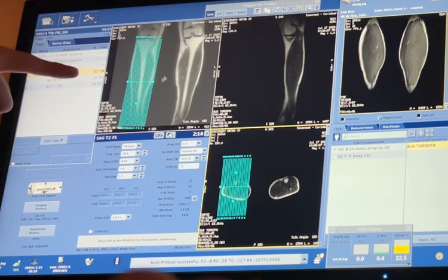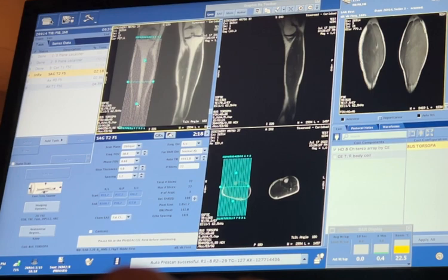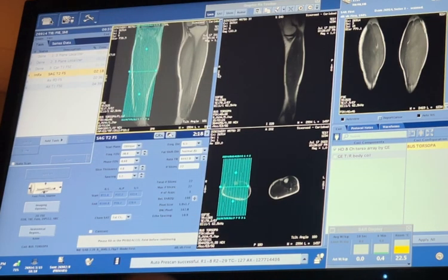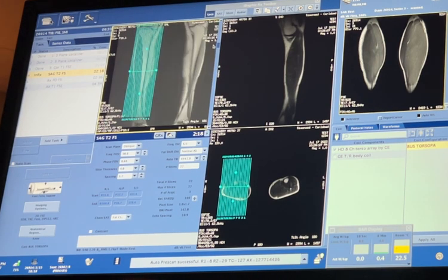And also let's replace this with the T1, the coronal T1. Hide the shim. Let's scroll through. We want to know where it is, and then we hide it. It's still there. There you go. Go back one more. Ta-da! We're going to image that.